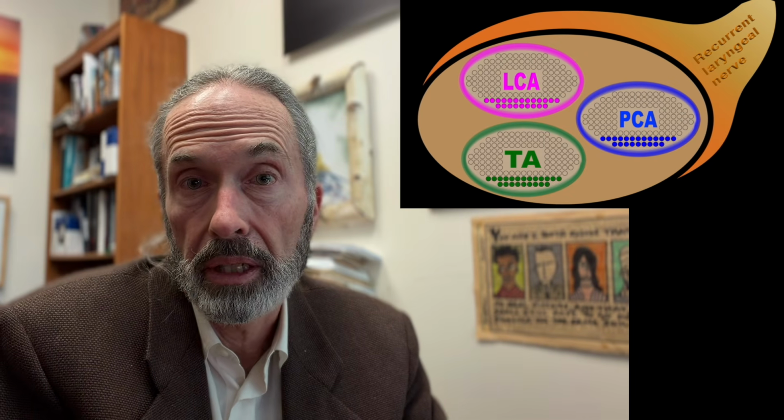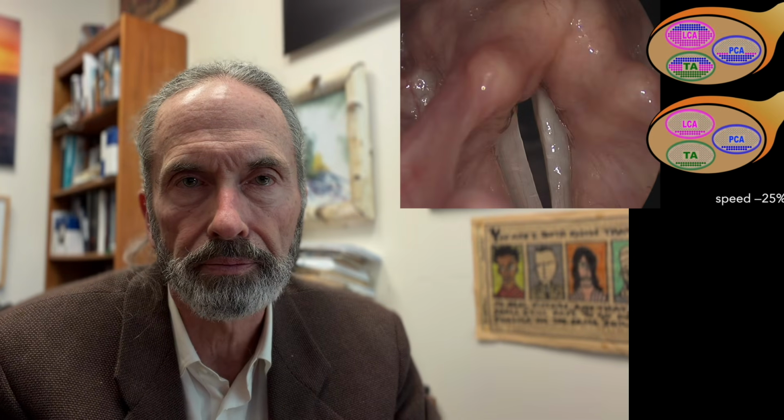But there might be another explanation: that this was injured some time ago and there are still some LCA fibers getting to the joint, the vocal process, but maybe there's a crossover and there are some PCA fibers in there fighting against it or pulling it the wrong way at the wrong time. So those are my imaginary two hypotheses for what might be going on.